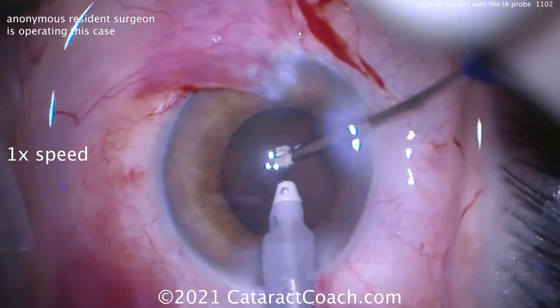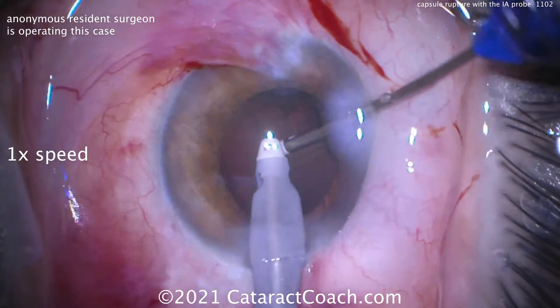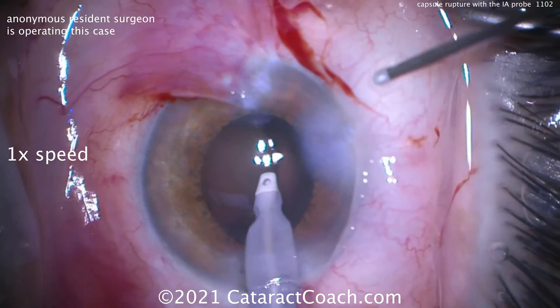Bimanual IA cortex removal, very carefully trying to remove the lens material — and there's a hole right there.